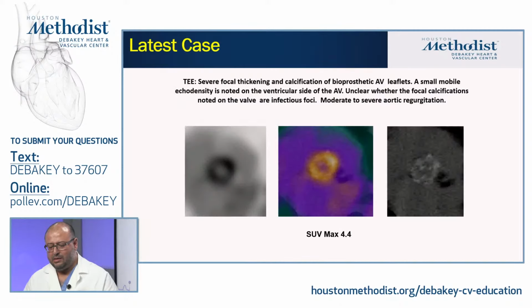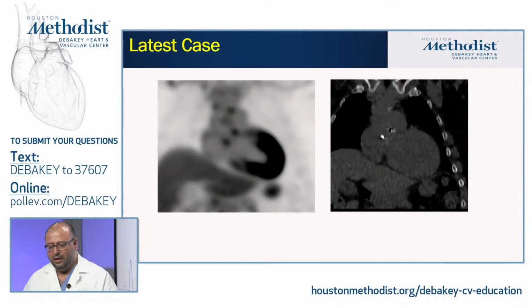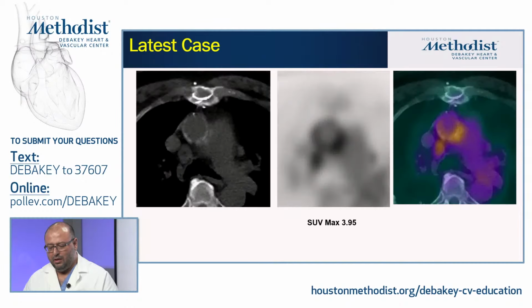For example, this is one of our cases. The patient had recent surgery, and there was a concern by TEE whether there is an infection. You can see low-grade but very homogeneous uptake, and on the CT there is some additional bioglue that was seen there, and this is not concerning for infection. You can see the bioglue here on this non-contrast CT. In the same case, you can also see the bioglue here.